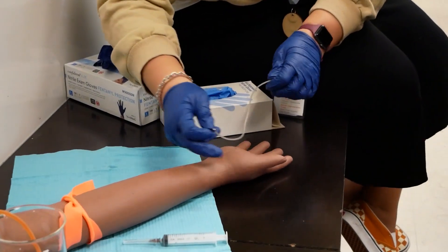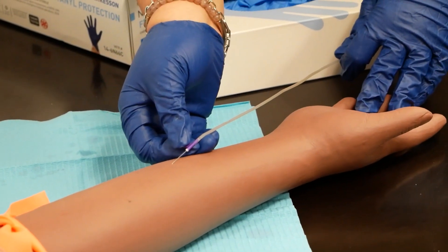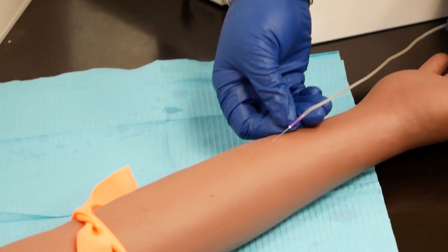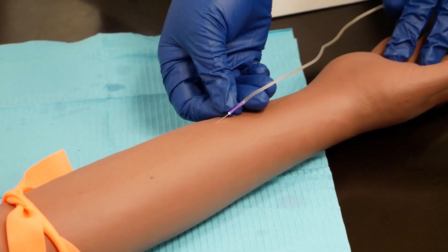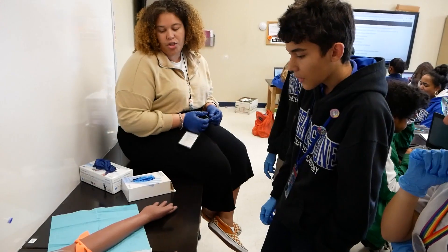When you're ready to put it into the vein, you're going to put it in at a little bit less than a 45-degree angle. We're not going to stab straight down — we kind of just want to go underneath the skin and into the vein. We have to be careful not to poke through the vein.